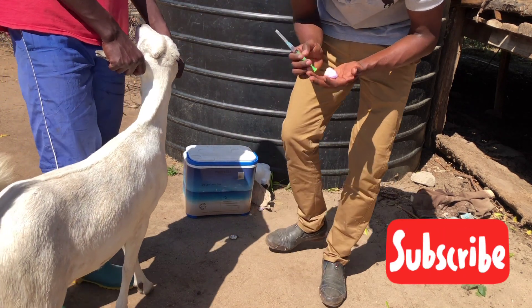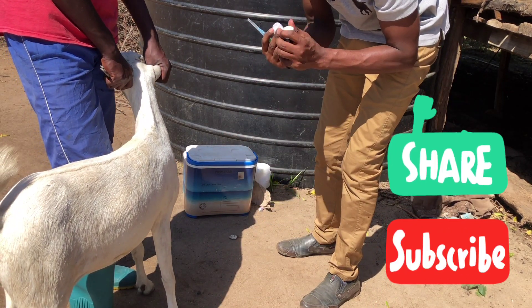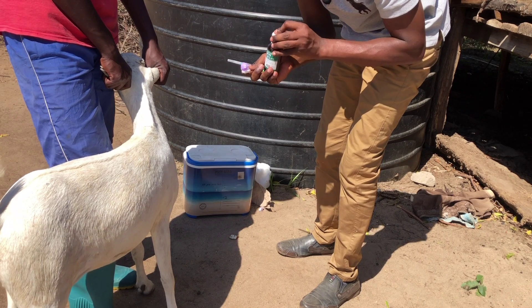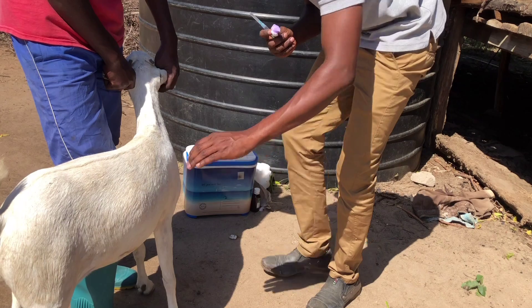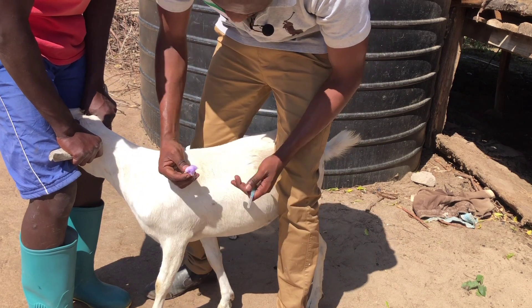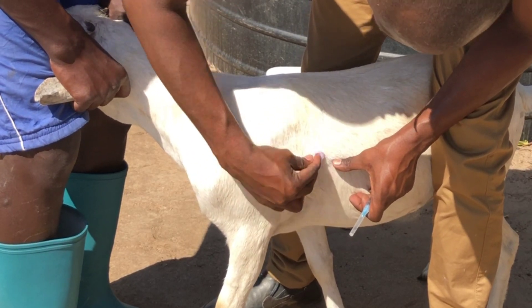Cover it well. Let me add a little more methylated spirit for better cleansing. The goat is making noise because her colleagues aren't here — she's alone and wondering what's happening. So again, this is how we clean the area we want to inject.